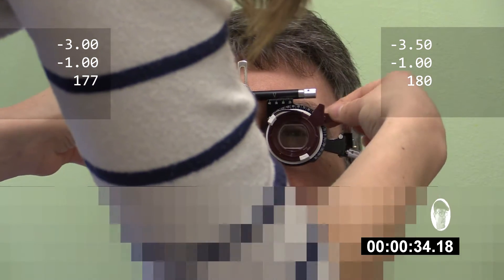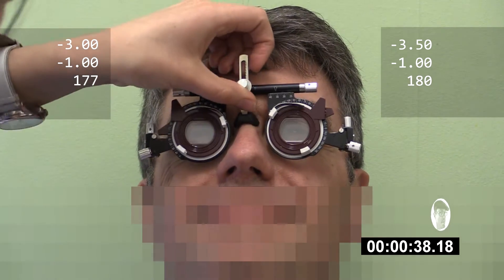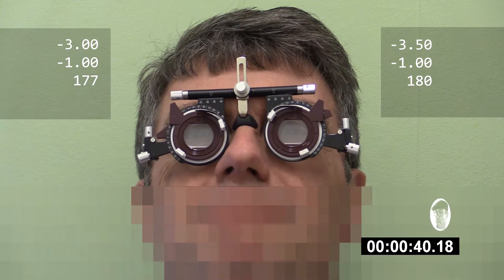So I don't know, I might be going to be off, but let's see here. Can you see anything? Yeah, looks good. Good, I love when you can see something.